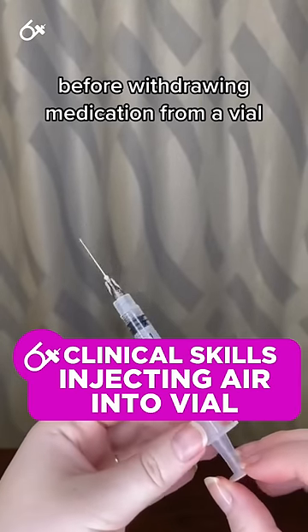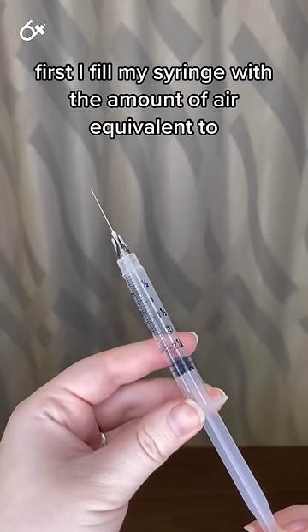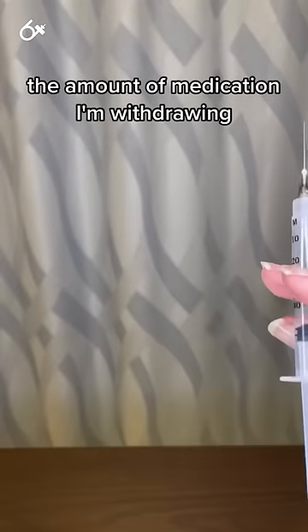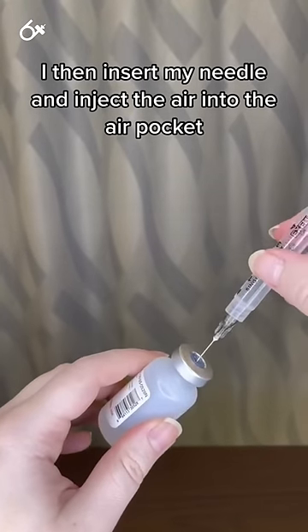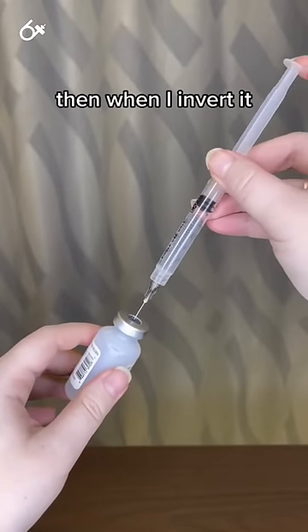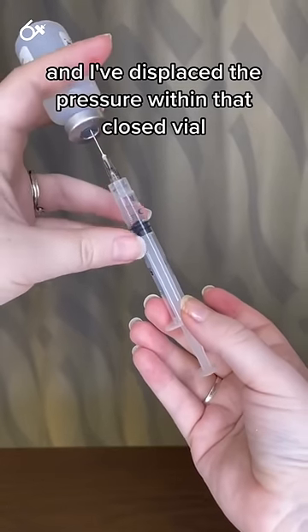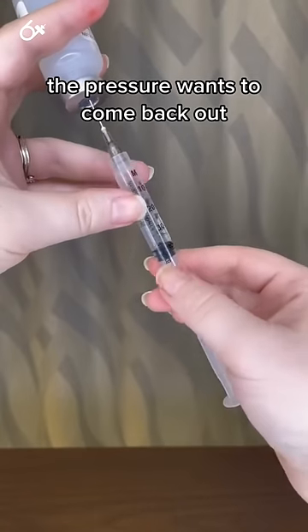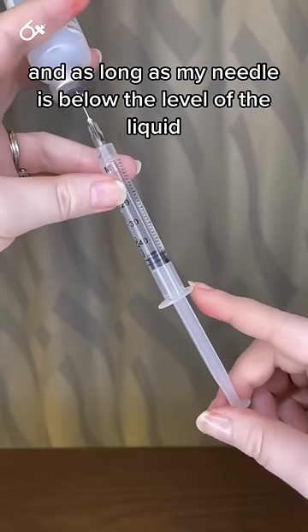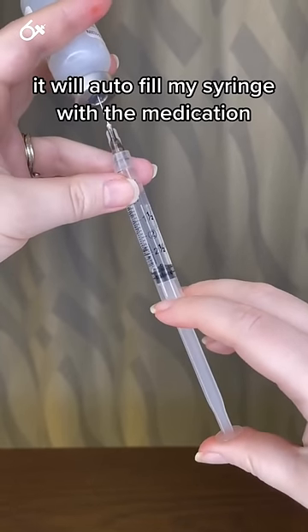Before withdrawing medication from a vial, first I fill my syringe with the amount of air equivalent to the amount of medication I'm withdrawing. I then insert my needle and inject the air into the air pocket. Then when I invert it, because I've injected air and I've displaced the pressure within that closed vial, the pressure wants to come back out — and as long as my needle is below the level of the liquid, it will autofill my syringe with the medication.